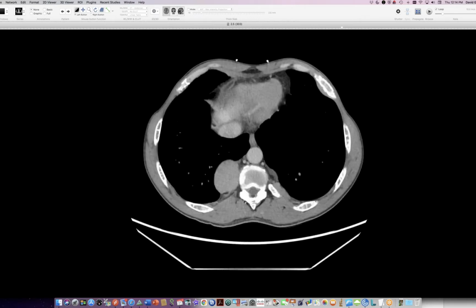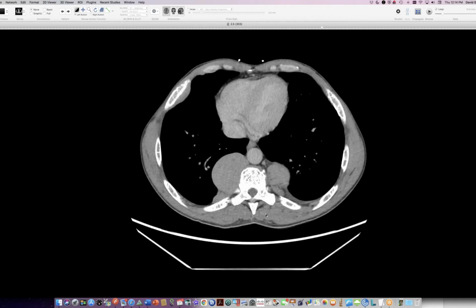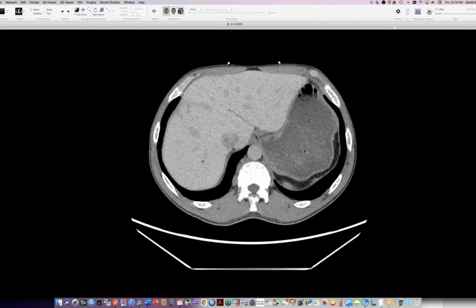I've seen extramedullary hematopoiesis in sickle cell anemia, but usually not to this extent. So this fantastic extent really goes with beta thal. The man was given an appointment in hematology, and of course he went back to California, so he's going to pursue the workup there. But we really have no follow-up, and he gave no history of having had a lifetime of thalassemia, which he probably has at his age of 43.